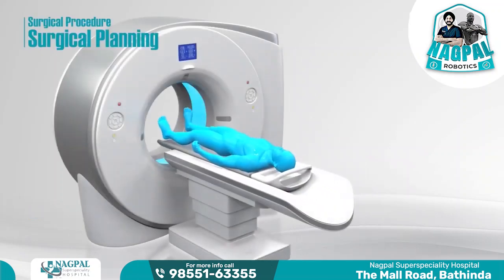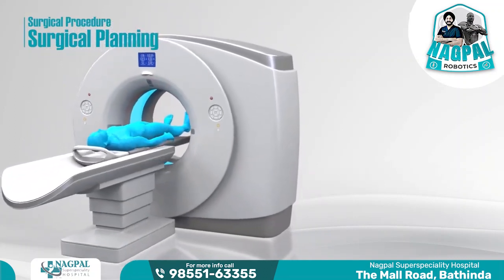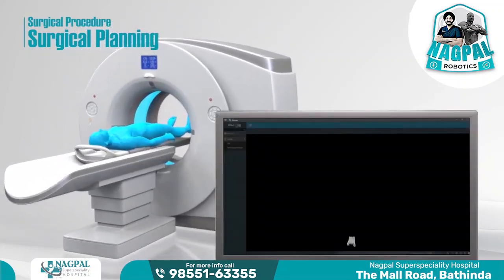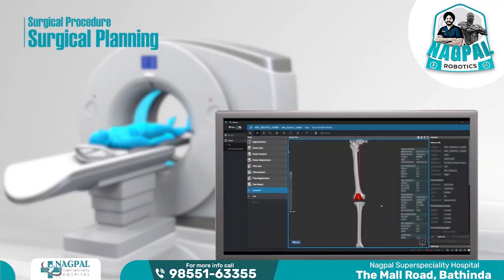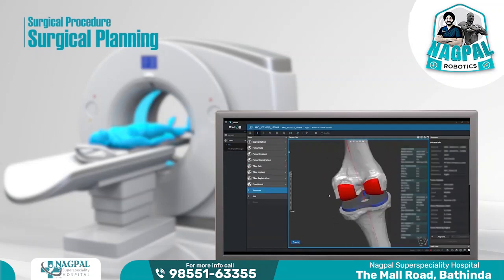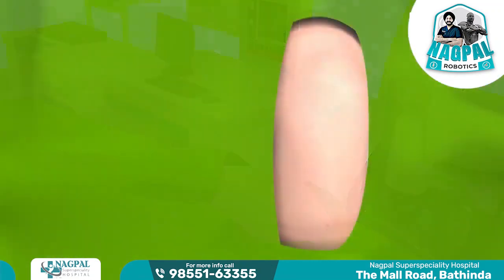For a personalized surgical plan, patients will take a CT scan. After the CT data is loaded, the planner will automatically create a 3D image. This will make a patient-customized surgery plan based on the patient's leg axis alignment, joint gap, the implant's orientation, and angle. Robot preparation is needed prior to surgery.